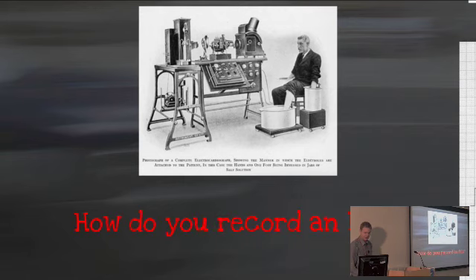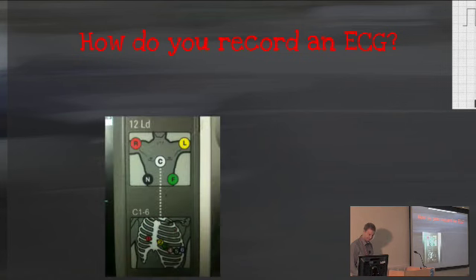So how do you record an ECG? Well, I'm going to go through that very briefly, because I think by fifth year you've generally recorded a few ECGs. You might have to do that in an OSCE, so I thought it would be useful just to recap.